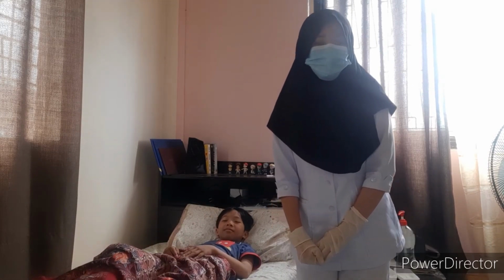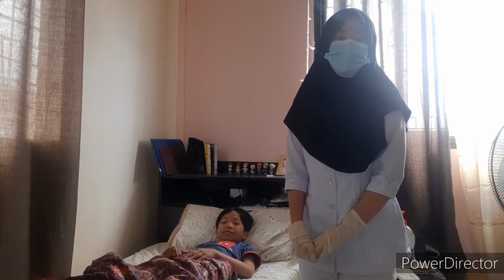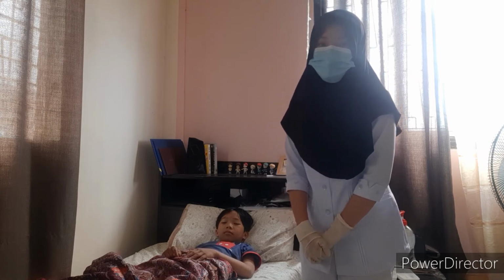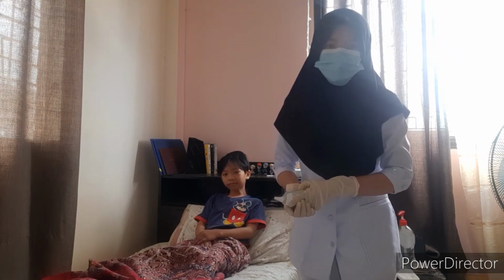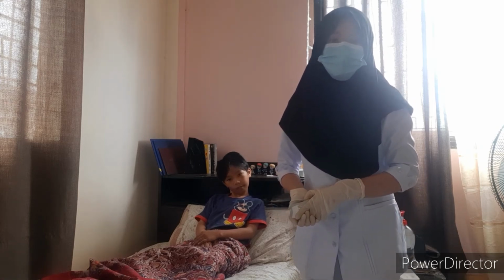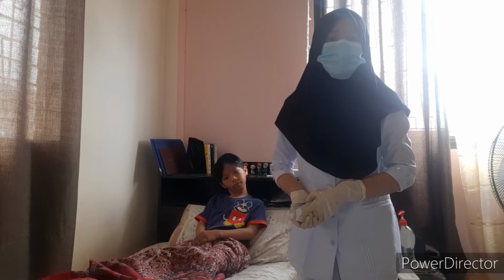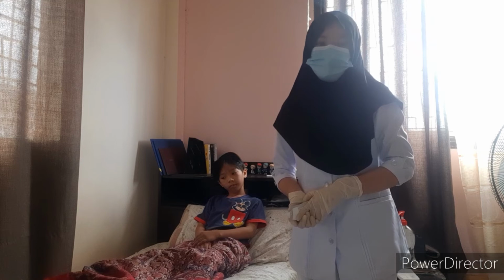So using a tympanic thermometer, before sticking the tympanic thermometer into the ear canal, make sure it's free of wax and dry, as ear wax may interfere with the tympanic thermometer reading. After turning the tympanic thermometer on and placing a sterile cover on the tip, hold the head still and pull back on the top part of the ear to straighten out the canal and make it easier for insertion. So to make it easy for the probe to be inserted toward the eardrum.